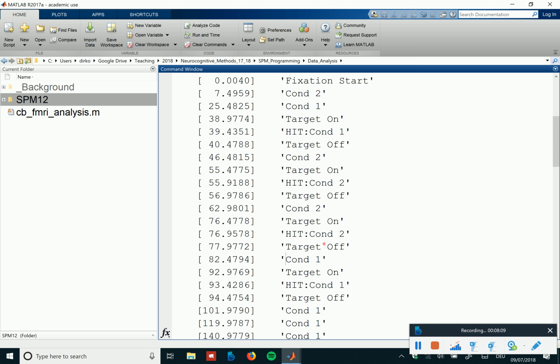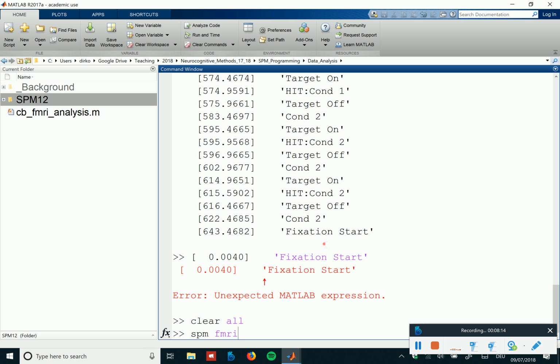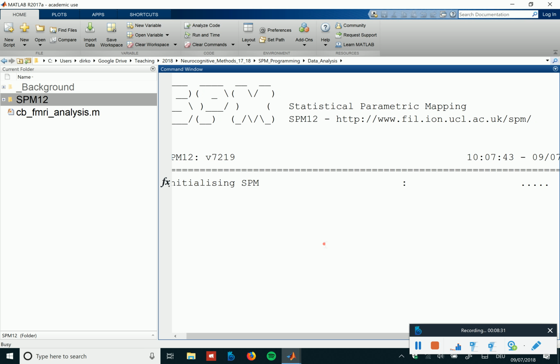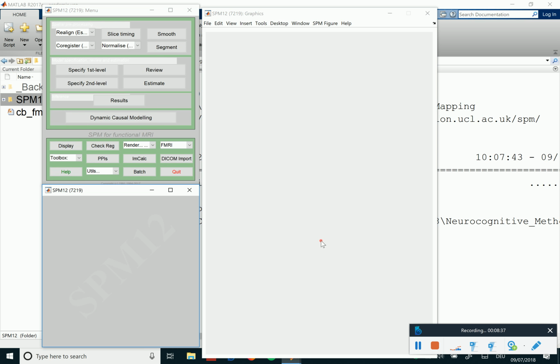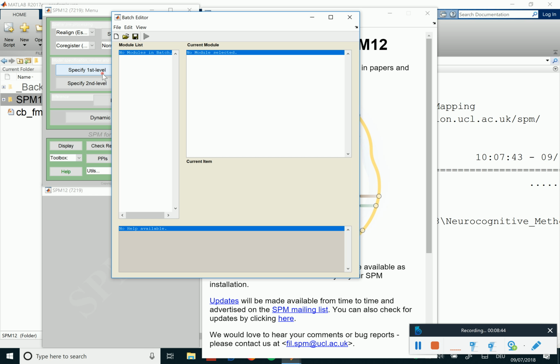So what we want to do is formulate a design matrix for each voxel, and of course, as you all know, for a design matrix, we need to specify what our regressors or conditions or effects of interest, however you want to call it, are. Let's see what's behind this. Oh, it just comes up with that.